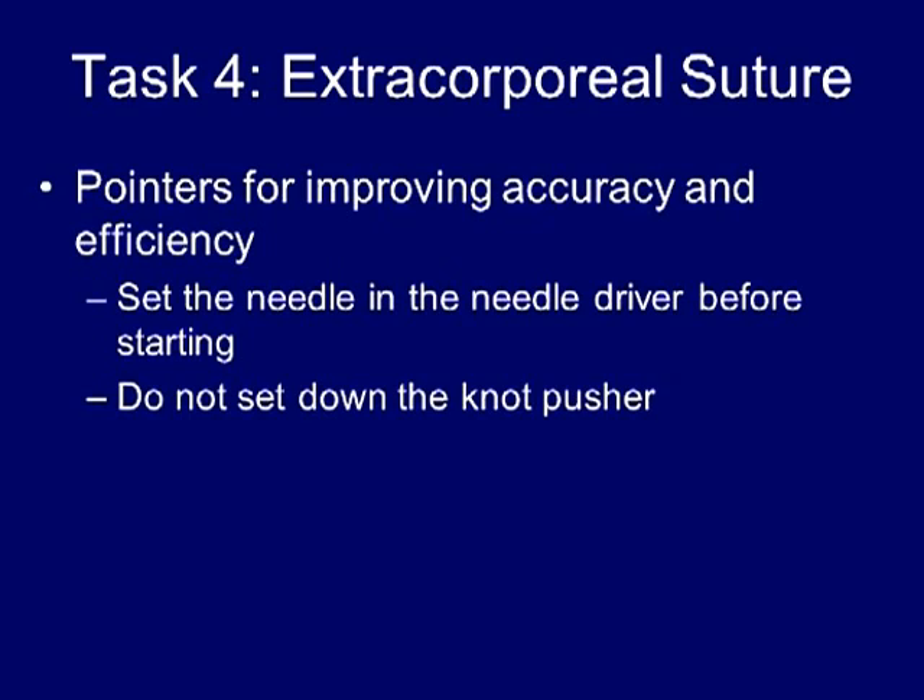This pre-orientation of the needle does not affect your time frame, and the time does not start until the suture enters the field of view. Also, do not set down your knot pusher between throws of the suture. The knot can be formed by simply palming the knot pusher and forming each successive knot, and it will be a lack of efficiency if the knot pusher is set down between each throw.